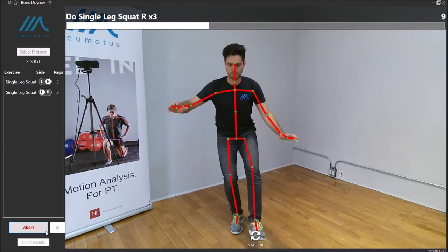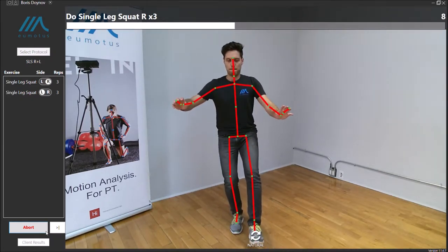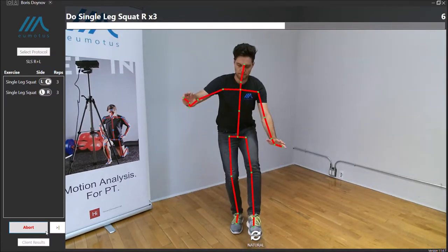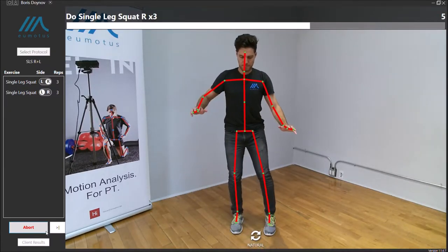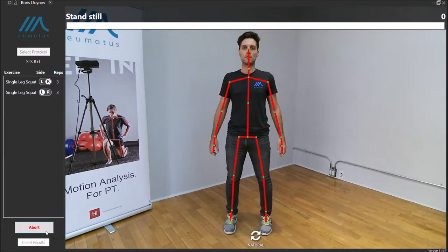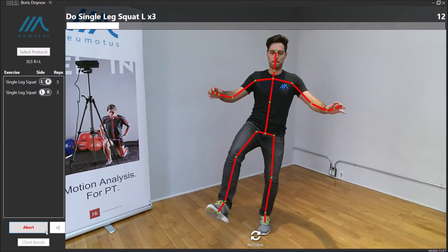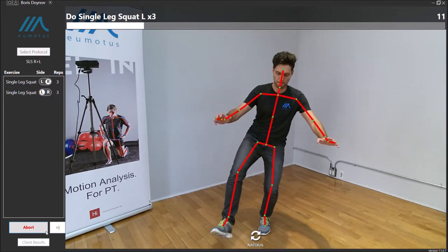Today we're excited to present our latest feature, the Umotis Auto-Analysis. We'll use Boris's single leg squats as a basis for our demonstration.